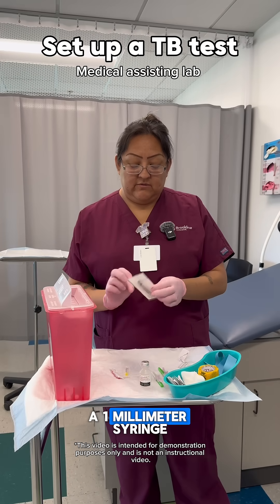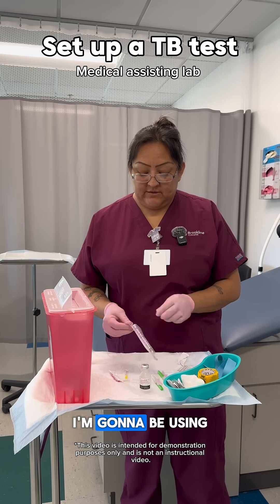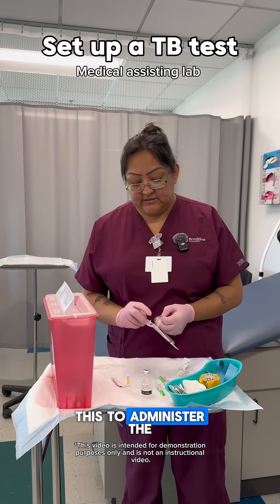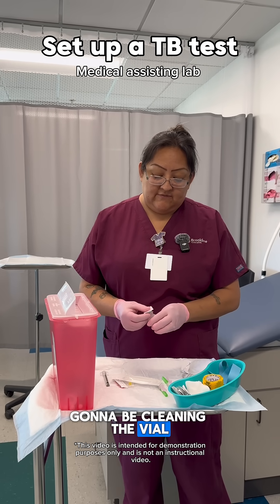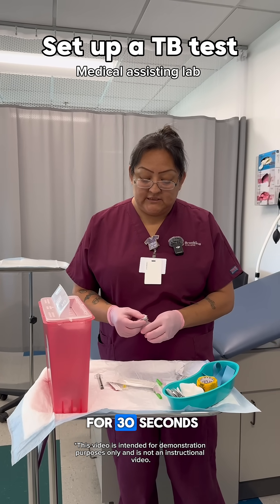Here I have a one milliliter syringe. I am going to be using this to administer the TB testing. I'm going to be cleaning the vial. We clean the vial for 30 seconds.